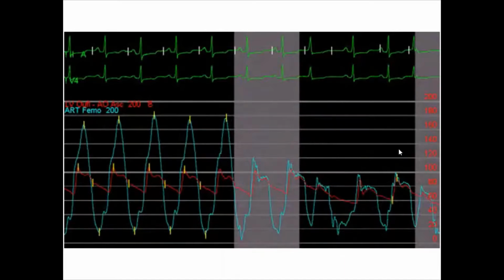In other words, if I took the tracing from my left hand to the right hand, concentrating on the LV catheter, there is a withdrawal or pull of the LV catheter from the LV cavity to the LVOT. Agree? Because of the same shape of the ventricular tracing.